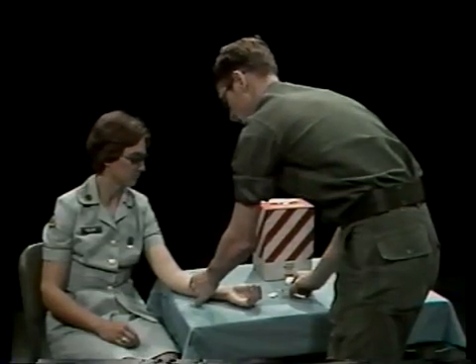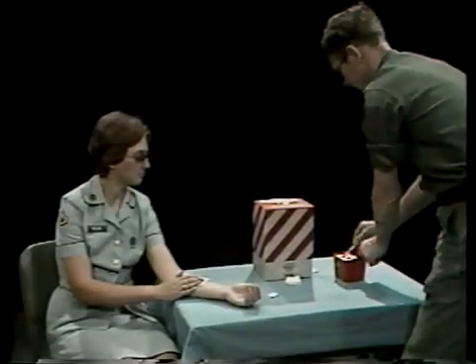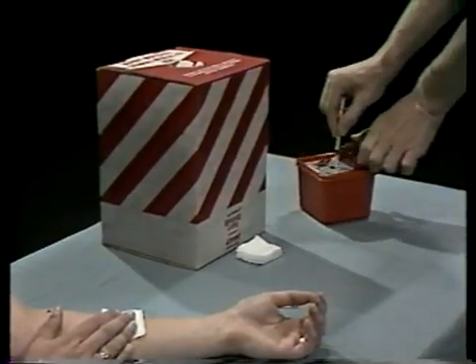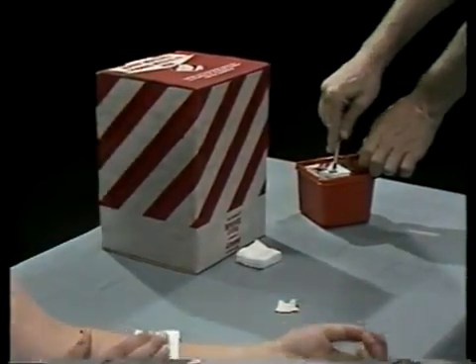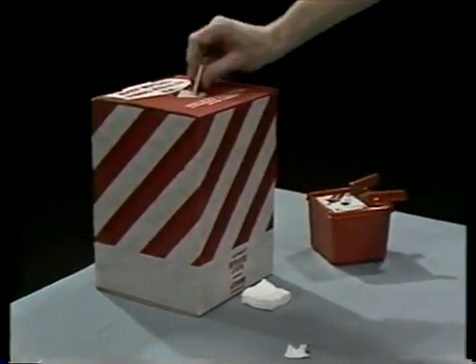When finished, dispose of your needle and syringe in the appropriate place. Now practice the whole task.